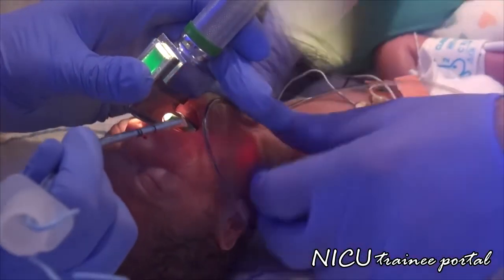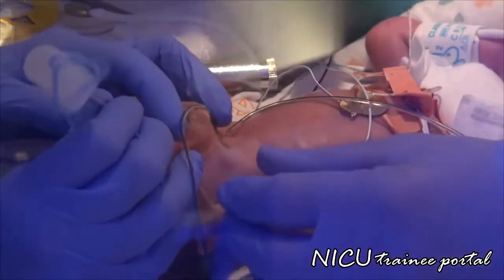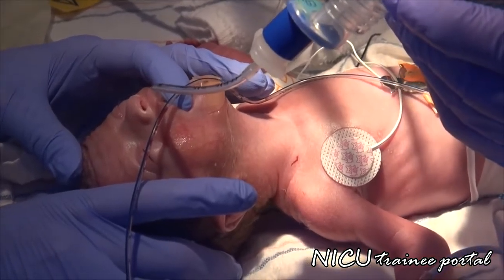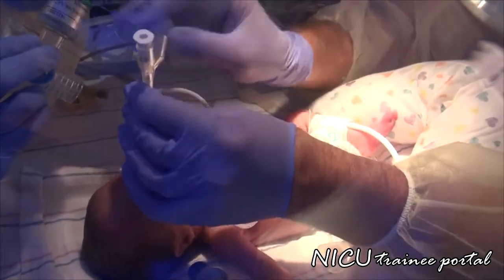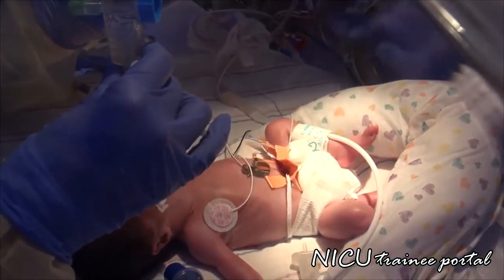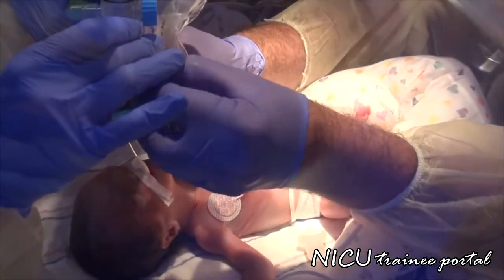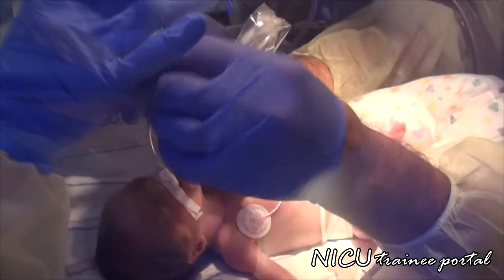Can you give me a little card pen? Yep. How far do we want to be down? Put them in just 7. Go ahead. You can take that out. I'm just putting the adapter on, and you can continue bagging. Now we're putting the multi-access catheter on.